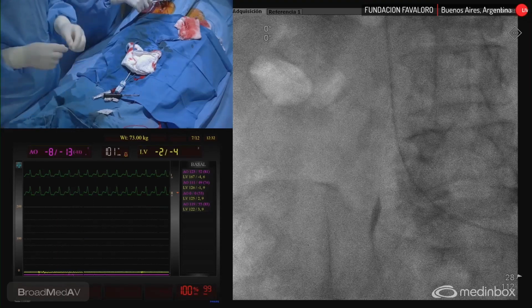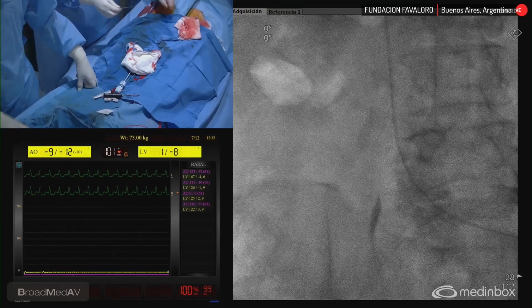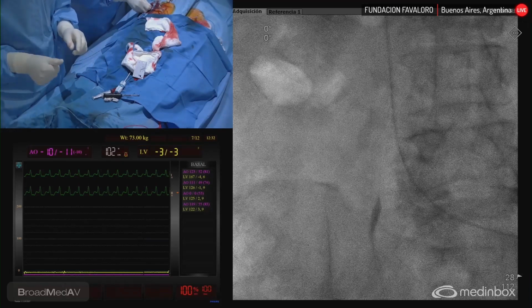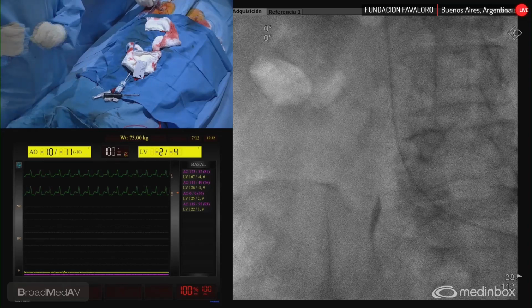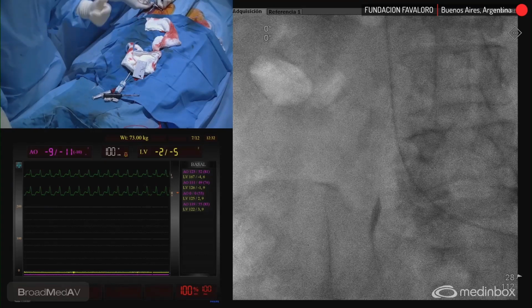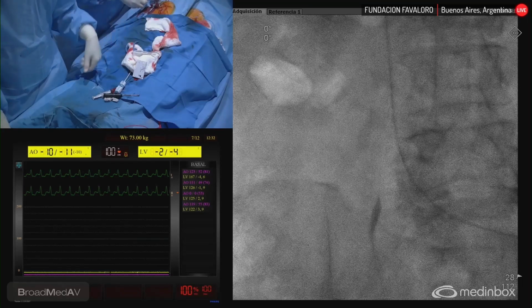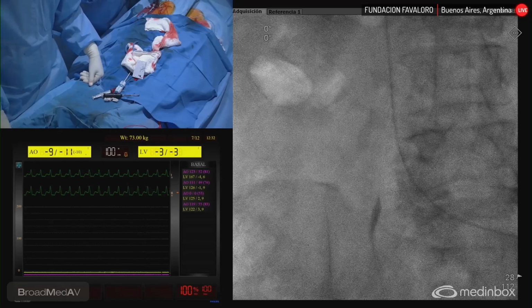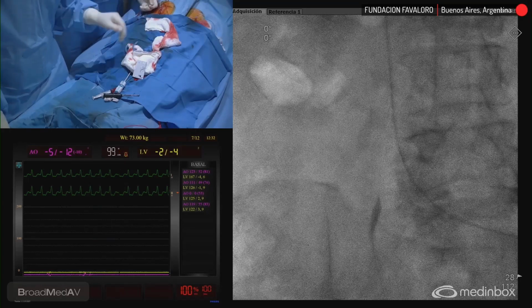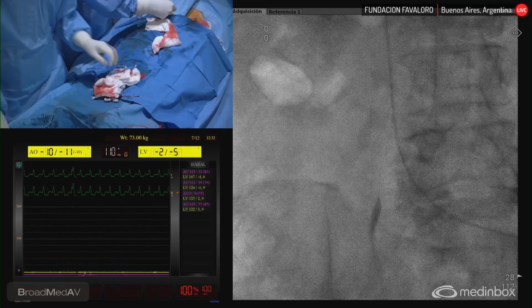Trying to sum up: leave a small hole to enter very easily and gently with the Angio-Seal, not trying to push too hard. If you have to push, I would recommend rotating clockwise and counterclockwise, but not pushing too hard, to prevent destroying the suture of the ProGlide, because remember, it's the only one you have. If you destroy the suture, the only solution is to go contralateral, inflate the balloon, put in a stiffer wire, go with a 6 or 7 French contralateral sheath, and deploy a covered stent if recommended, or surgery, which is the other possible solution.